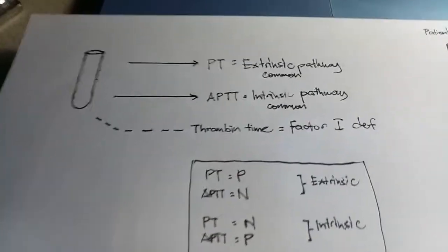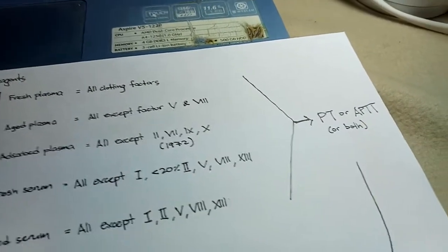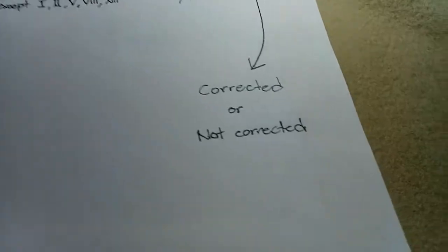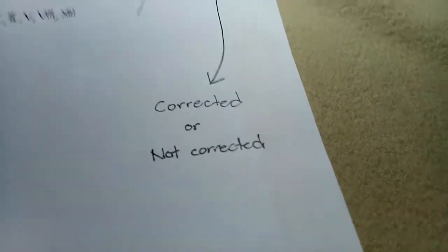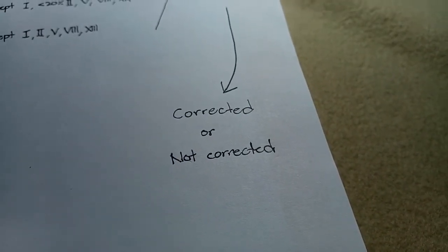So, ang result neto tsaka ang result neto i-compare natin. Okay? So, doon na natin malalaman if corrected or not corrected.